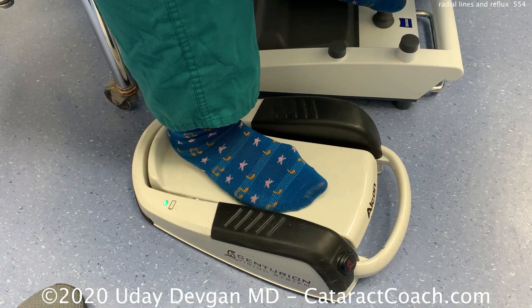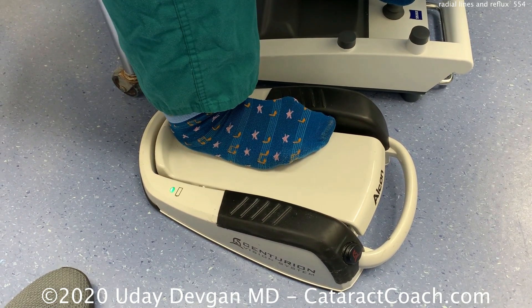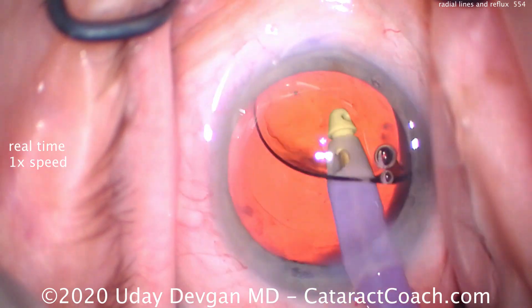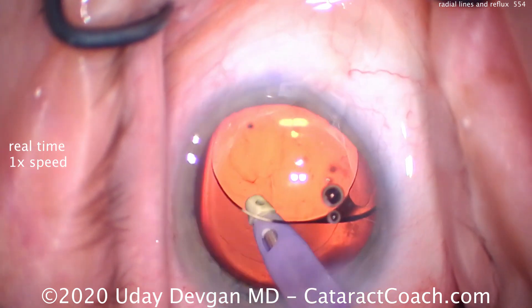Here's the sound the machine makes — [reflux sound] — so that's the sound of reflux. When we operate: release it and back to normal.